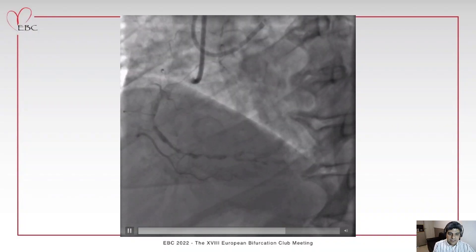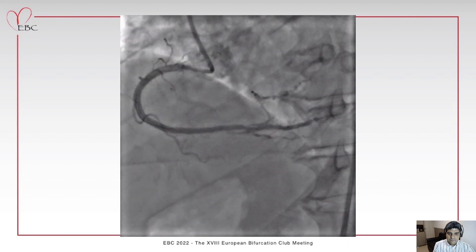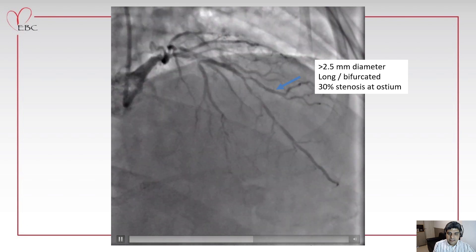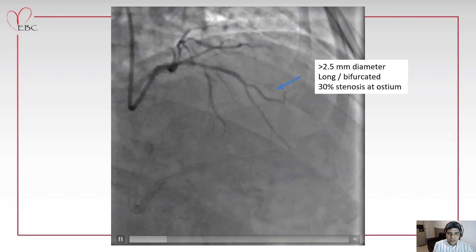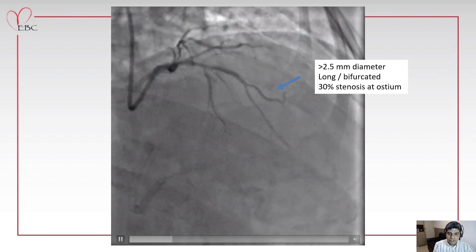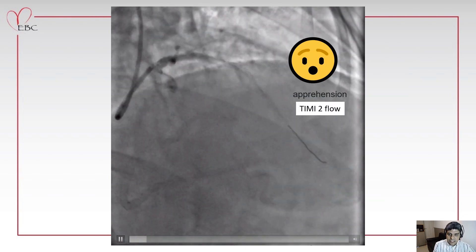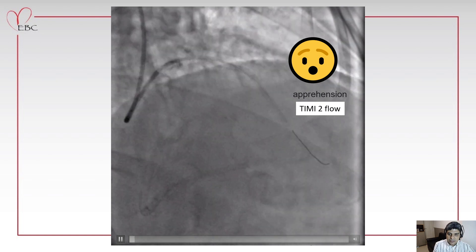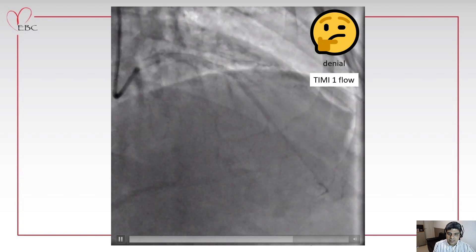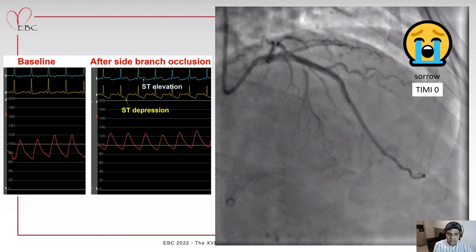This is an example of a multivessel PCI. We started doing the RCA, which was a CTO, and after that we went for the left main and LAD with diffuse disease. We planned to work as fast as we could — it was the last case of the day. We started with a provisional approach and didn't put the wire on the diagonal branch. After stenting from left main to LAD, we got TIMI 2 flow on the diagonal branch with no wire on it, and after a few minutes the flow was getting worse, and finally we lost the side branch.